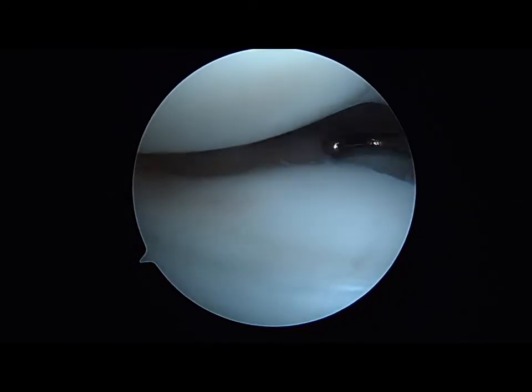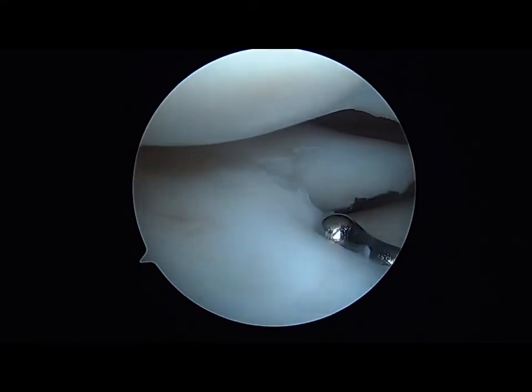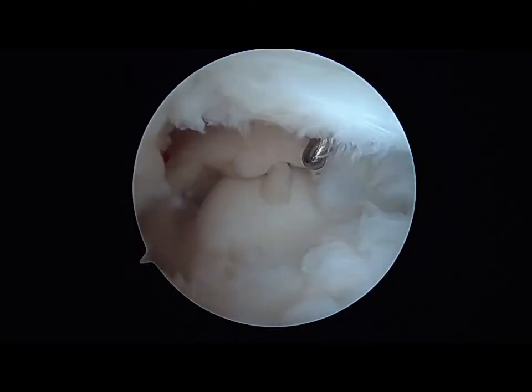Probing of the posterior, lateral, and the anterior margins of the meniscus is performed to further assess stability.